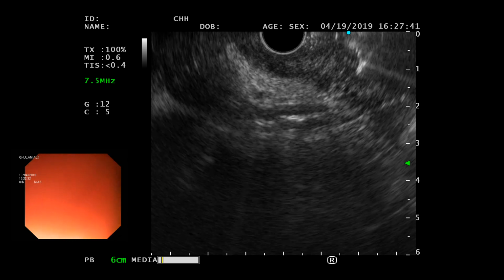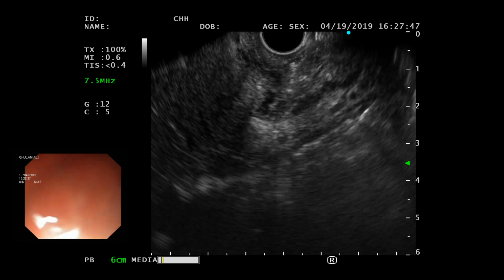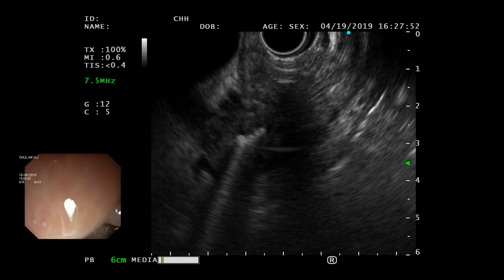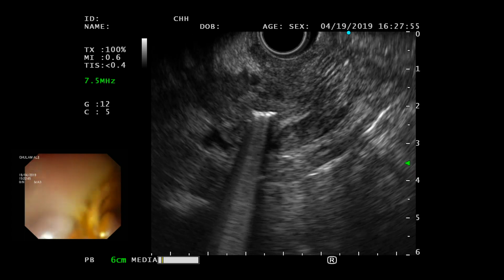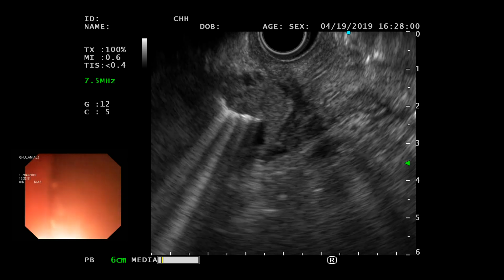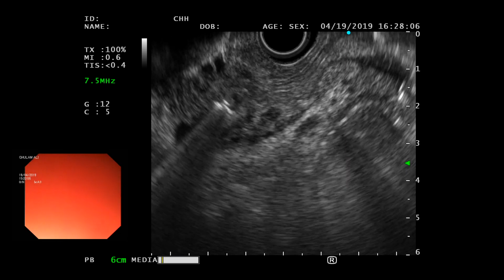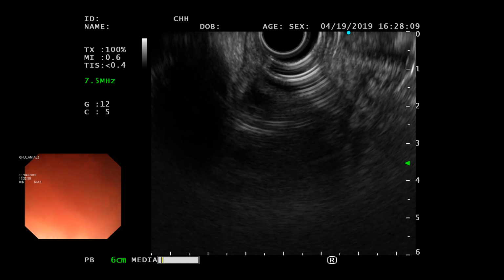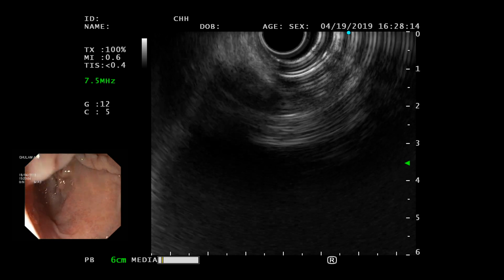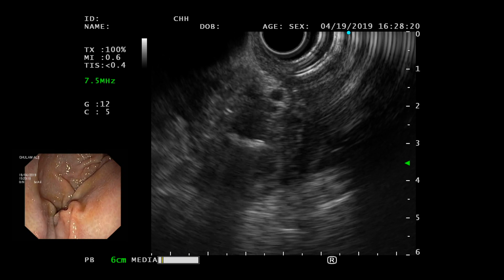If you have a 5 centimeter lesion, then you need all the way to, because that is your maximum yield. Inflate, okay? Don't go without that. If there is no inflation, don't go. You don't know where you are going. Endoscopically, you need to know where you are going. Okay. So if you were going there blindly, you have no idea where you are going. Okay. And you are not even close to that.